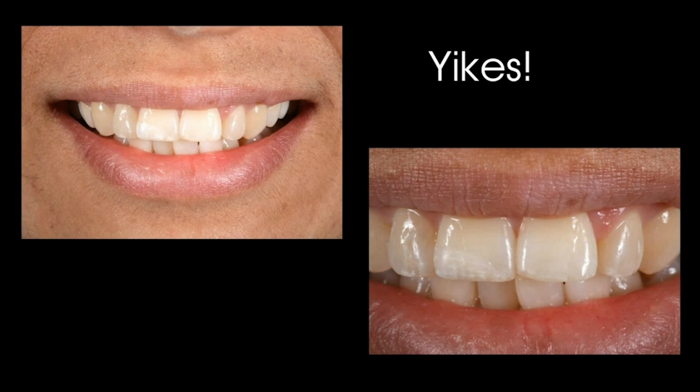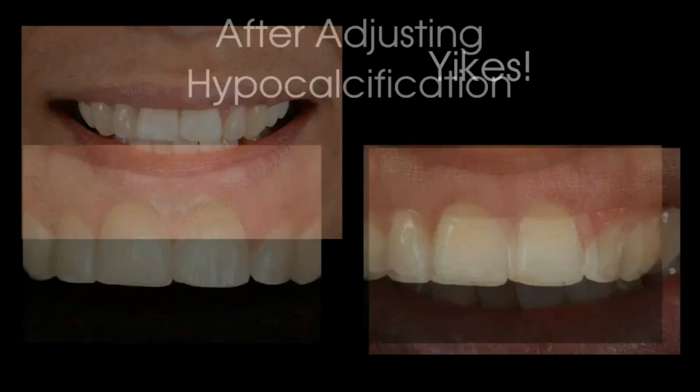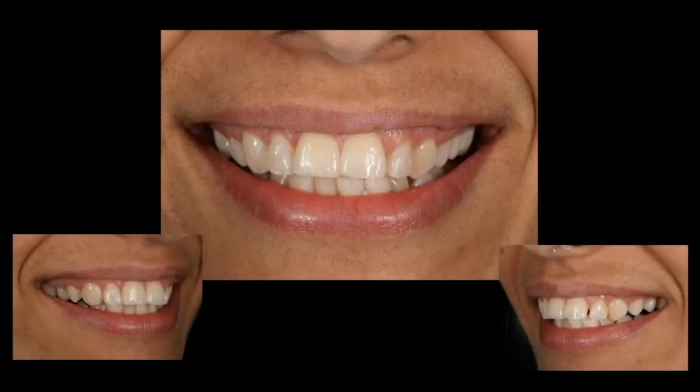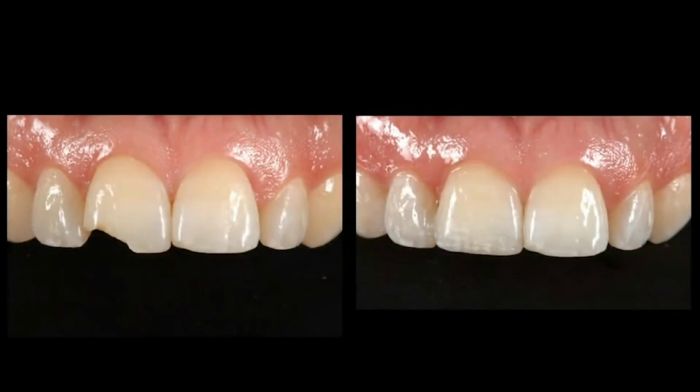So he made me another one, but there was a little bit too much hypocalcification on it. So after adjusting the hypocalcification, I think here's the end result. We ended up with a pretty nice class 4 on tooth number 8 there. And here it is close up. So I think that was a pretty good result for what we ended up with as a partial veneer.